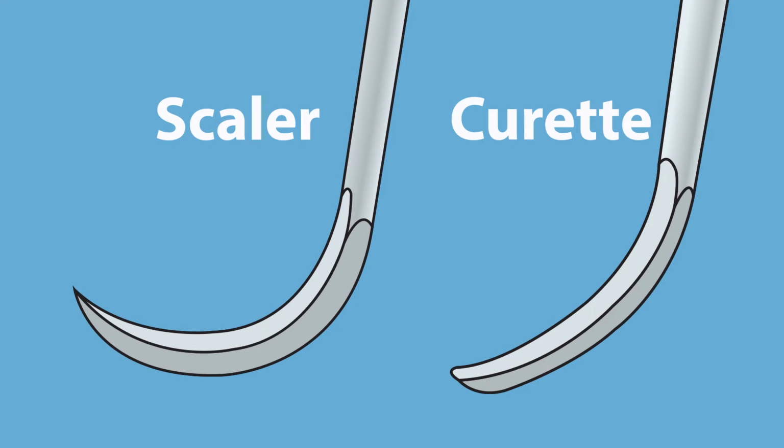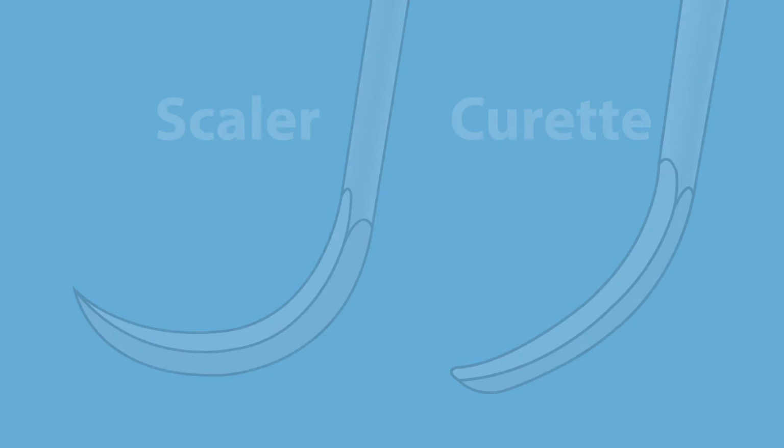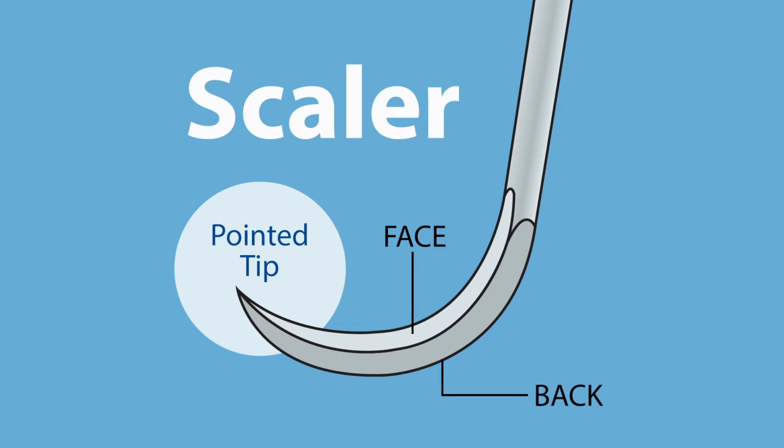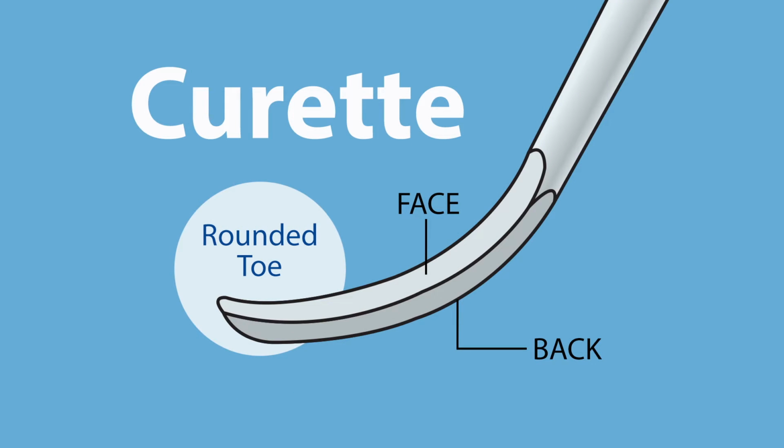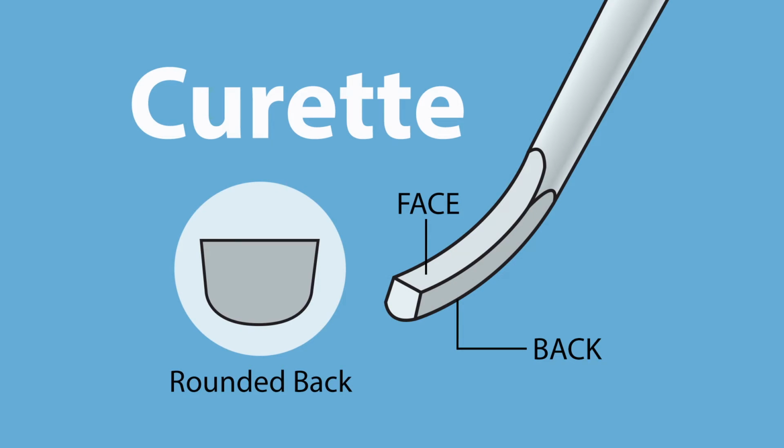When comparing the differences between a scaler and a curette, you will find that the scaler has a pointed tip and triangular back to the working end, whereby the curette displays a rounded toe and smooth rounded back to its working end.